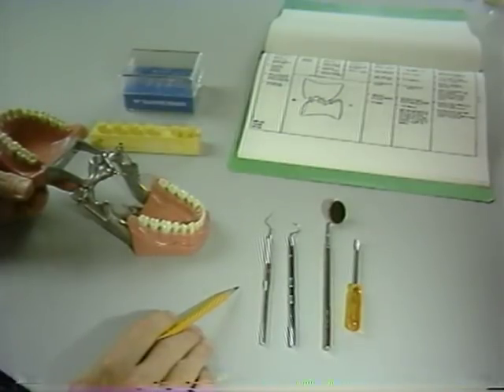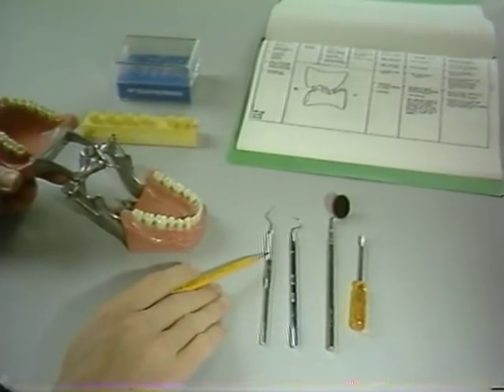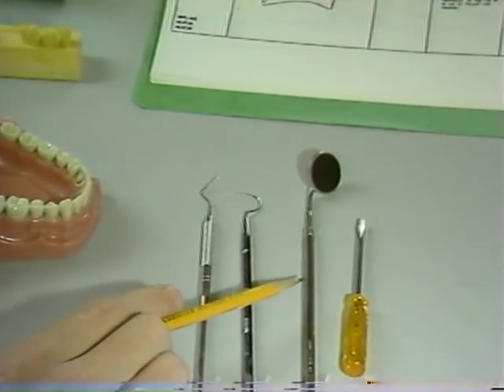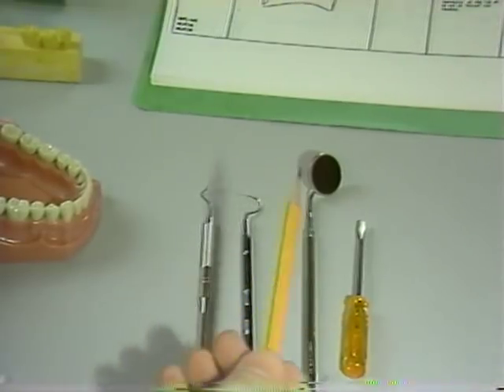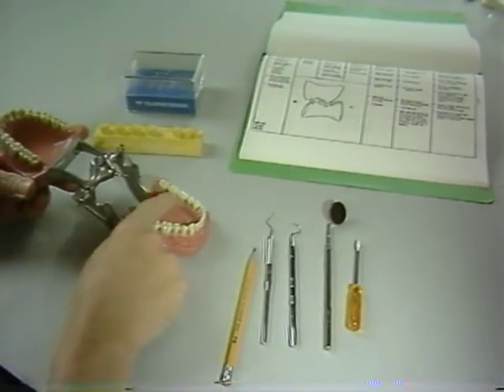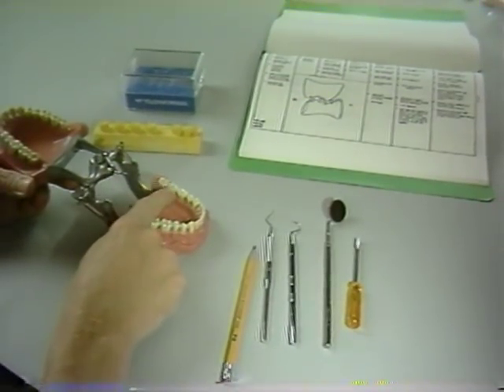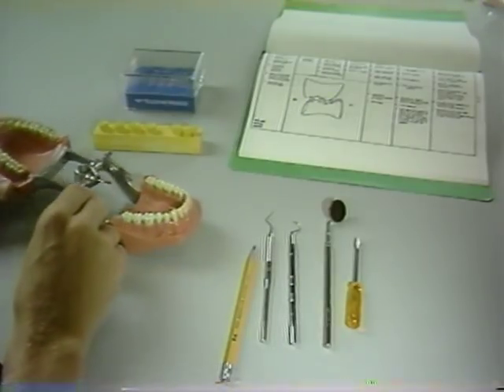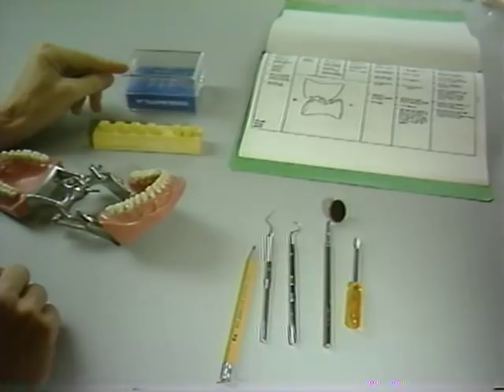On the mandibular molar, you will require the armamentarium that you see here in front of you. You will need a peri-probe, a sharp explorer, a mirror, your dentiform screwdriver, a sharp pencil, and of course the equilibrated Dentec with centric stops evenly distributed throughout the arch. Make sure that your complete assortment of diamonds is available, and also the carbides should be displayed at this time.